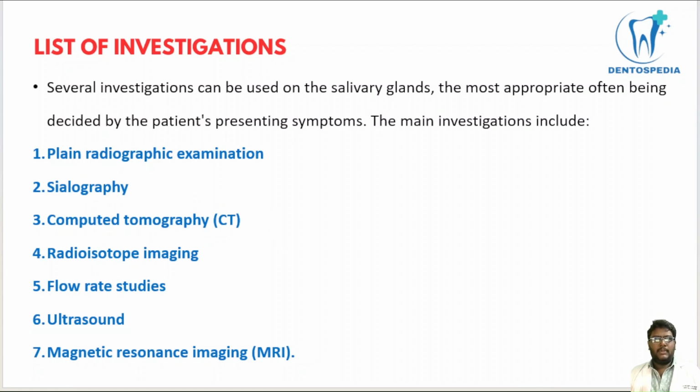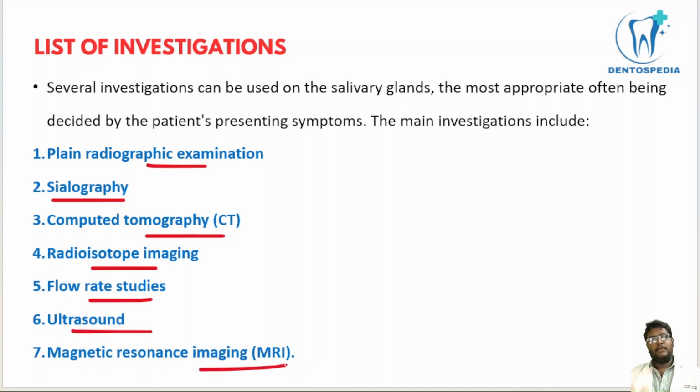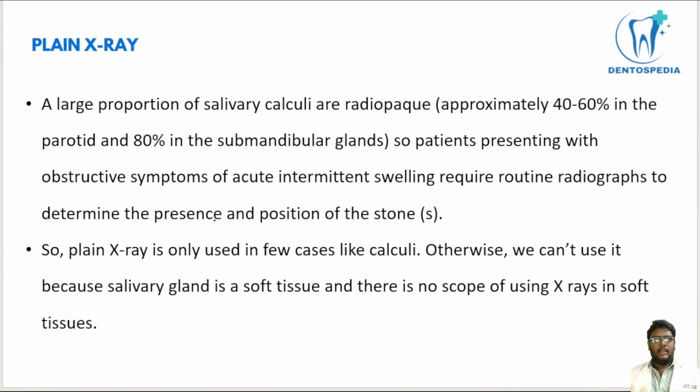They are plain radiographic examination, commonly called as plain X-ray. Okay, sialography, which is a kind of invasive procedure, CT scan, radioisotope imaging, flow rate studies, ultrasound, and MRI scanning if necessary. Okay, and coming to the first investigation, that is plain X-ray.